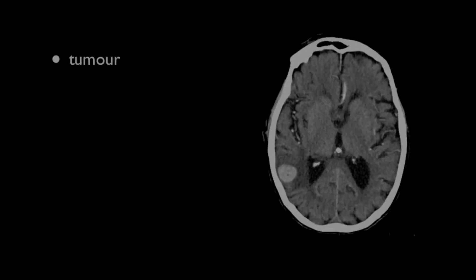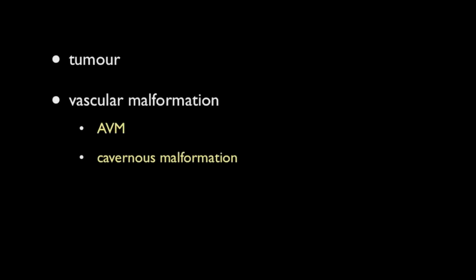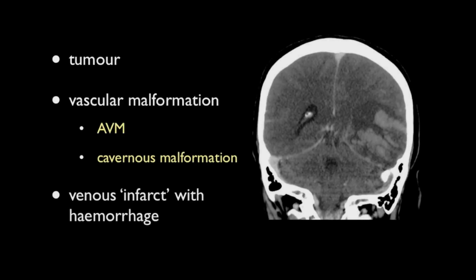When evaluating patients with a large superficial hemorrhage, it's important to keep in mind the possibility of underlying lesions, especially in young patients. An underlying tumour, an underlying vascular malformation such as an arteriovenous malformation or a cavernous malformation, as well as venous infarcts should be considered. The latter typically has a very heterogeneous or gyroform appearance to the blood, and is located in parts of the brain drained by adjacent dural venous sinuses.